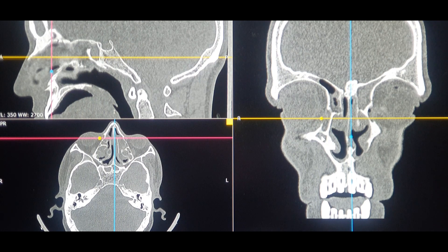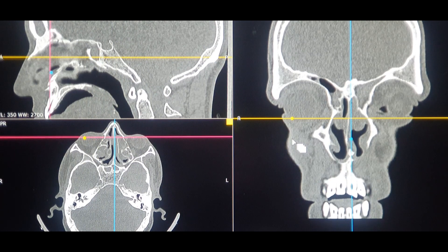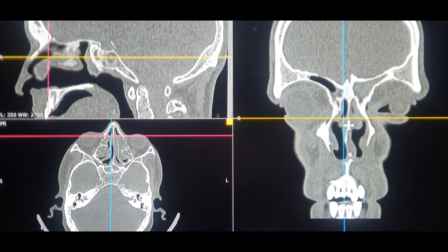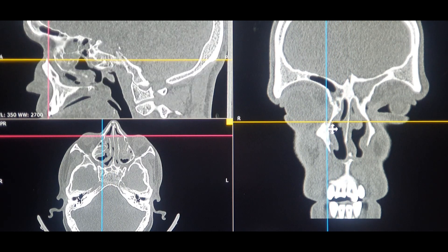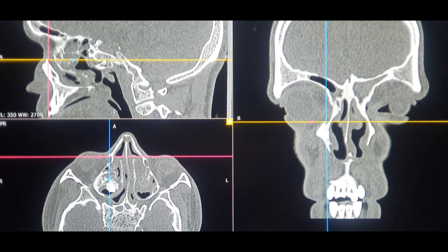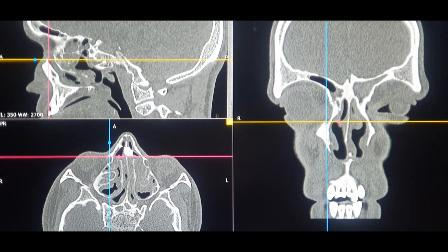This opacity is the lacrimal sac, and that's also the most initial part of the maxillary sinus. Once you locate the lacrimal fossa, you go to its most anterior aspect — roughly this area is the anterior lacrimal crest. On the sagittal section you can cross-check this, and on the axial section you can actually see the lacrimal sac area at the most anterior aspect. This is the anterior lacrimal crest, and this is how you precisely locate it.